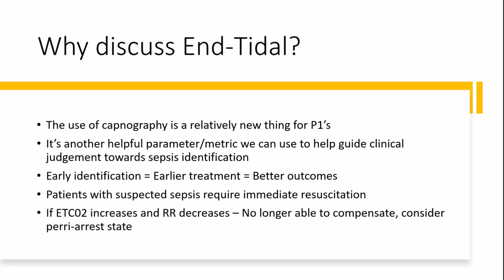The use of capnography is relatively new for, let's just say, the service I work for. But if you do work in a service that has used capnography, it's another helpful parameter or metric we can use to guide clinical judgment towards sepsis identification. Remember, the underpinning goal that we have as pre-hospital providers and clinicians in the sense of sepsis is that we need to be able to quickly identify it, which allows for earlier treatment, which allows for better outcomes.